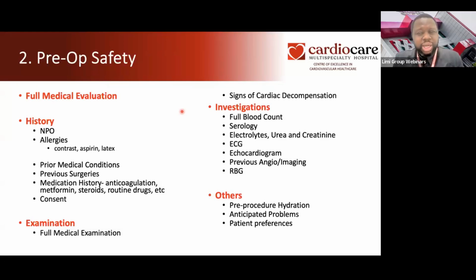Then check, have you signed a consent? Remember that it's a procedure, and the ethical thing to do is to make sure that an informed consent is signed. Even though we know that this procedure is likely safe for most cases, over 99%, there is still a possibility of complications, which can happen with any procedure just like this.